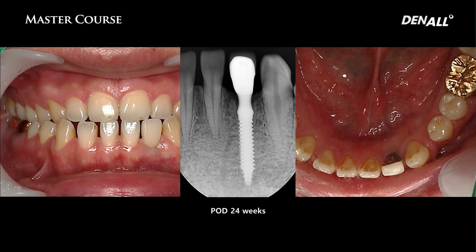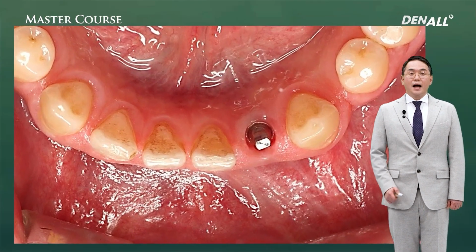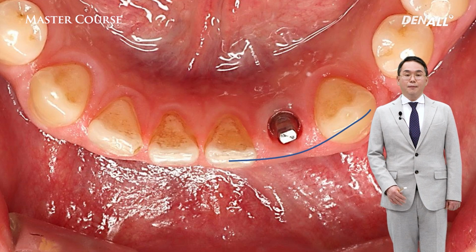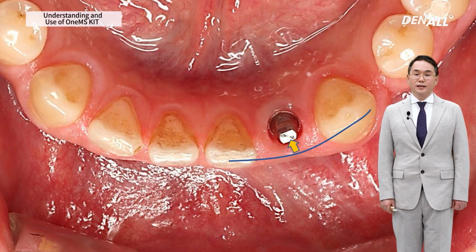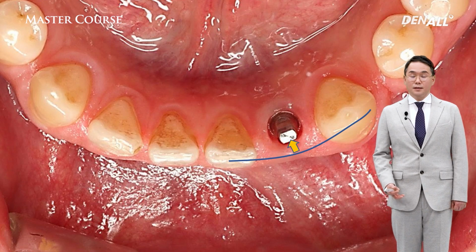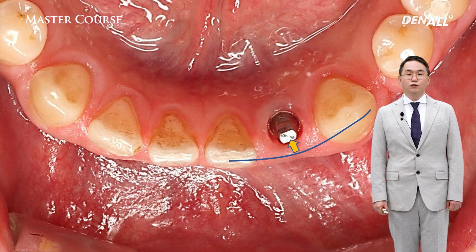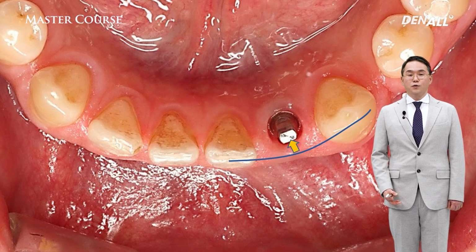The MS implant is a one-body type, simplifying the prosthetic procedure. It requires very accurate placement. The ideal MS implant position would be a little bit lingual to the virtual line connecting the labial surfaces of natural teeth. It requires accurate drilling and accurate implant angulation and position. It is a one-body implant. It is very hard to bend the abutment part or grind it off, hard to modify, so accurate placement is required.